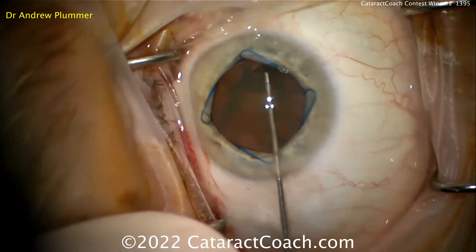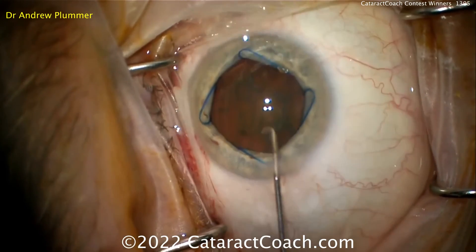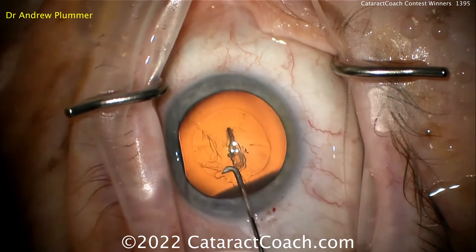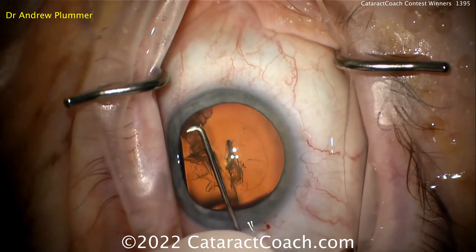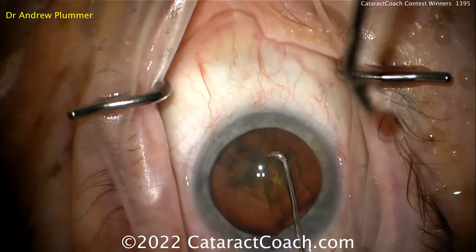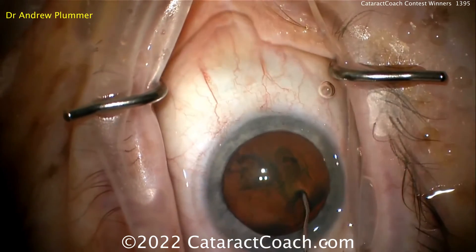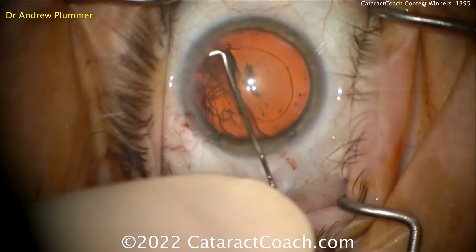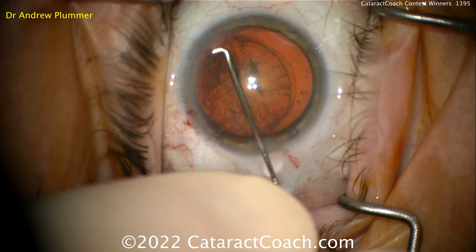The last thing is that I will depress the lip of the main wound as I squirt fluid, which allows some egress of viscoelastic. That maintains the chamber equilibrium so you don't build up too much pressure and blow out the posterior capsule. Hopefully this video shows that with purposeful and efficient technique, hydrodissection can be a very predictable and repeatable phenomenon.